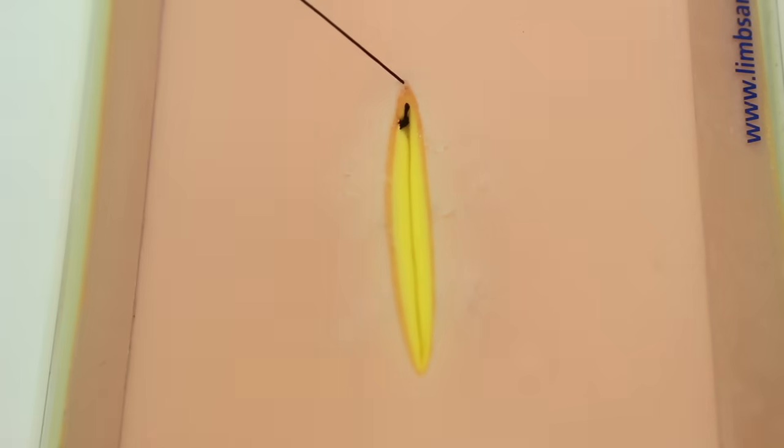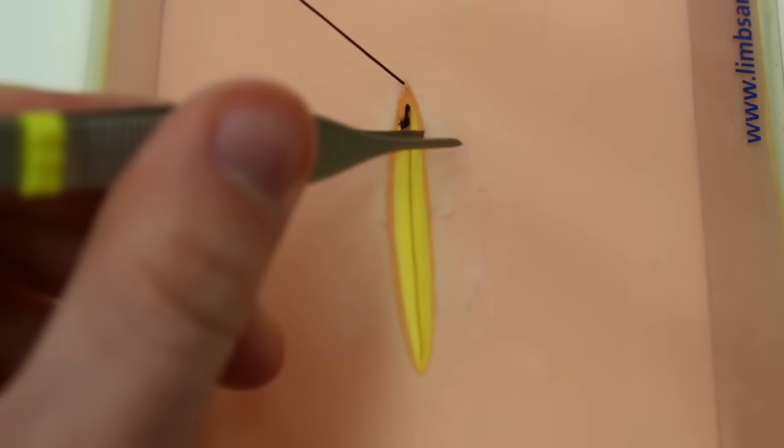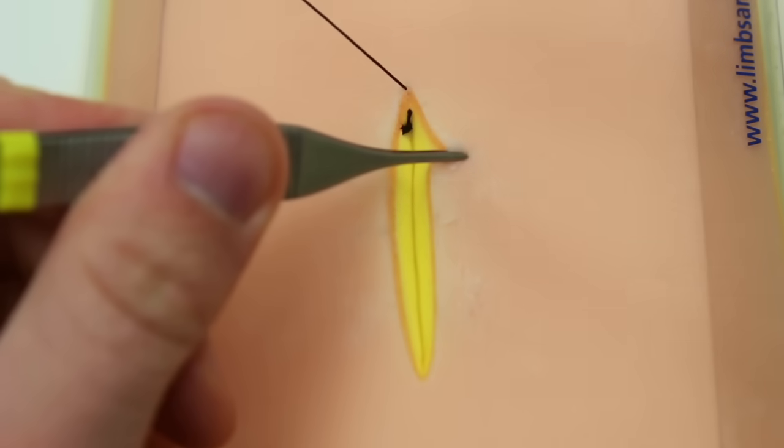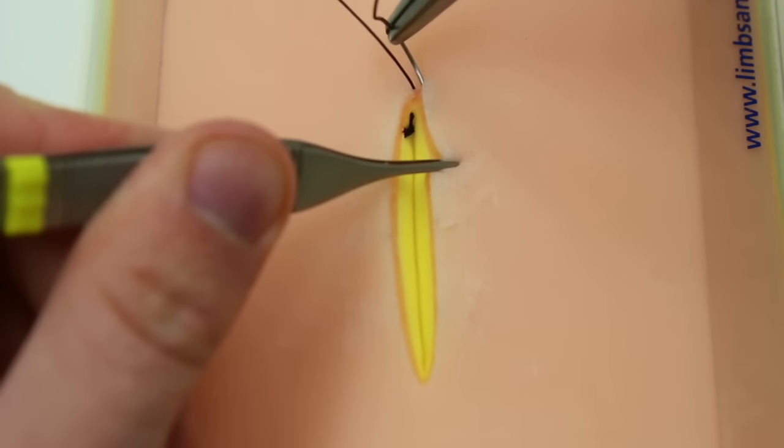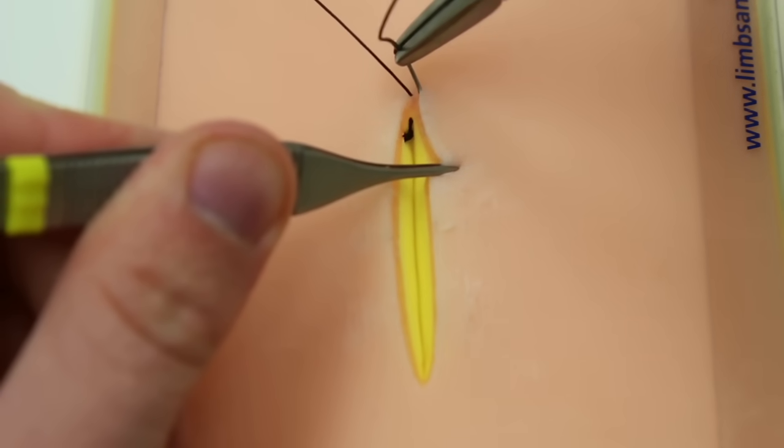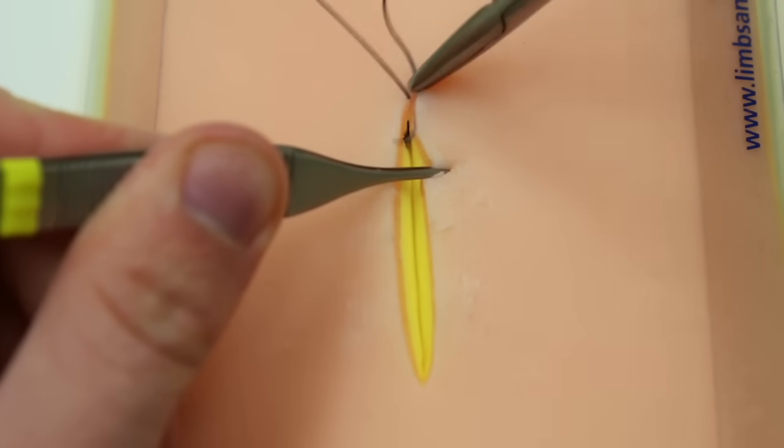Now load the needle towards yourself. Your first pass here, you're going to start right where your incision comes out, right at the dermal-epidermal junction. Moving the skin, coming out right at the dermal-epidermal junction.